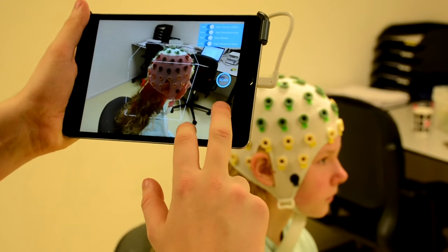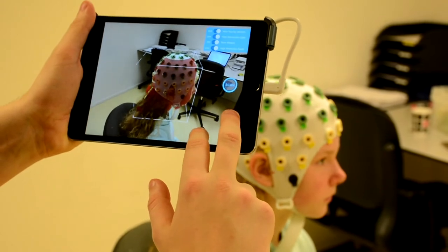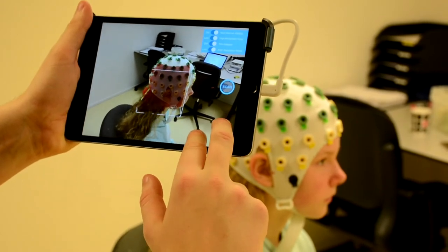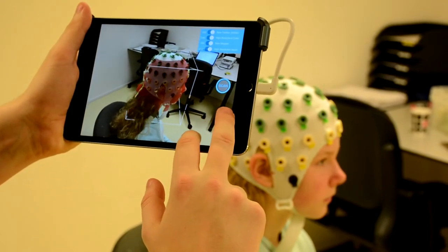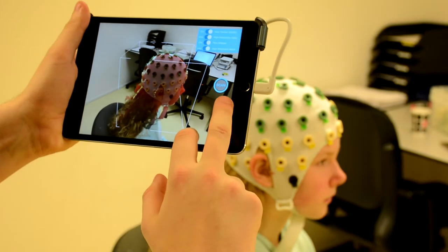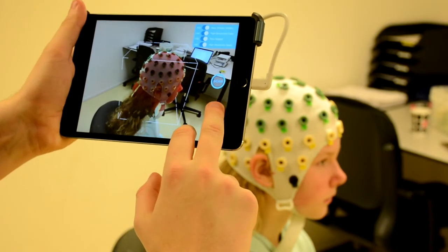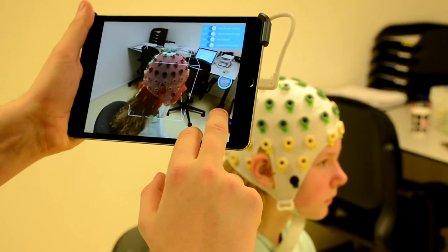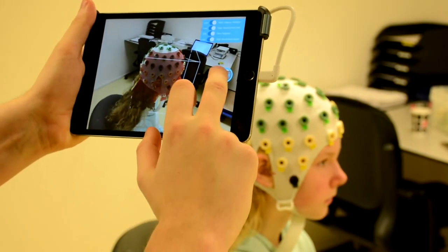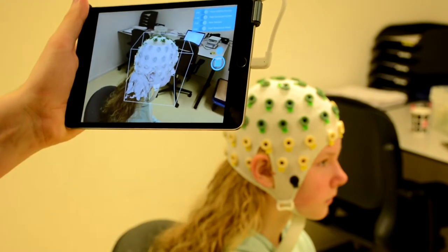Then we start using the 3D scanner. First of all, we have to specify the bounding box we want to measure. This is too big, a little bit smaller. This is good, so we press scan and start.